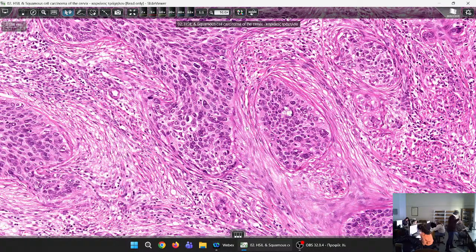In this case, you have to perform hysterectomy and remove the whole uterus with all the surrounding fat tissue, because you have to look there for lymph nodes and see if they are metastatically infiltrated, and you have the staging, the pathologic staging of cancer. So this is how we discriminate true invasion, like this field here, from participation of the endocervical glands in high-grade dysplasia. Is that understood? Okay?